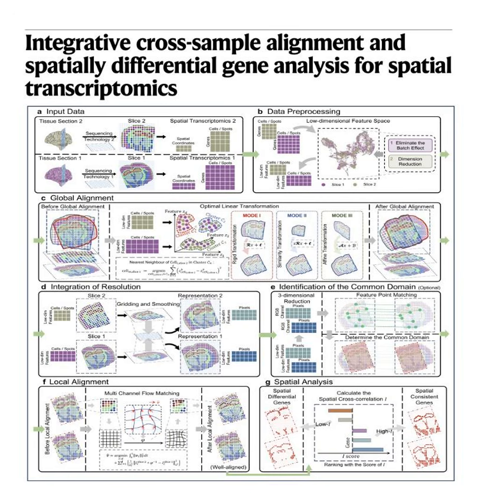Okay. That stands for Large Deformation Diffeomorphic Metric Mapping. Yeah, I'm going to need you to translate diffeomorphic metric mapping into plain English. Fair enough. Think of it as a mathematical rubber sheet. CODA constructs a vector velocity field. What that means is it calculates the exact trajectory needed to smoothly and non-linearly warp the tissue coordinates back into their true biological shape, pixel by pixel. Oh, I see. It corrects the tiny local tears and microscopic ripples, gently pulling the individual cells precisely into alignment without breaking the overall continuous structure of the tissue.